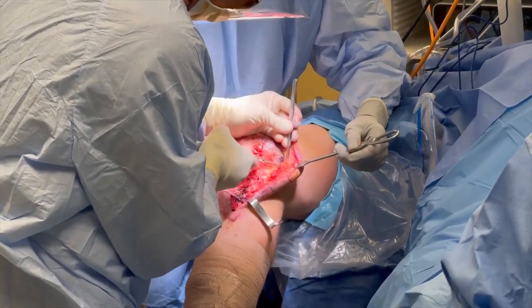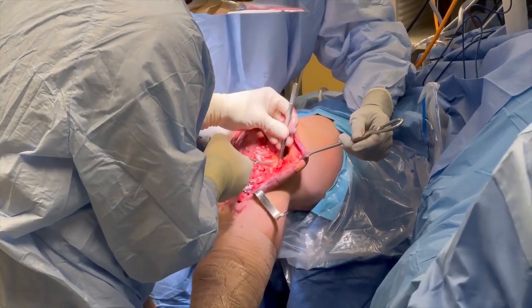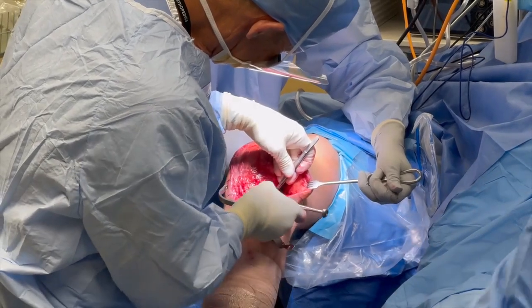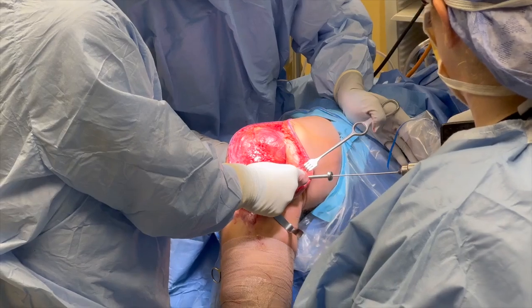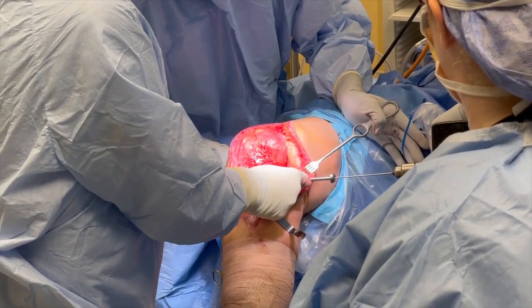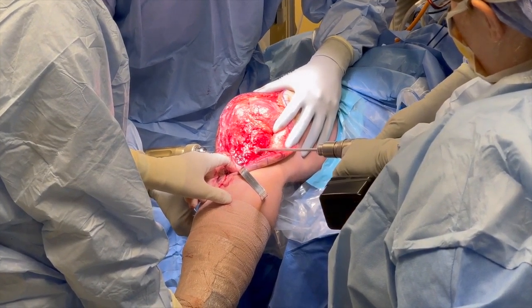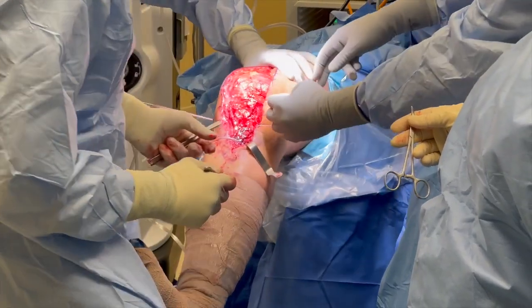Next, the site for the POL tibial tunnel is approached, just distal to the anterior arm of the semimembranosus tendon. This location is marked, and a guide pin is drilled perpendicular across the tibia using the collateral instrument tibial guide, exiting at Gerdy's tubercle. The guide pin is overreamed with a 7 mm reamer to a depth of 25 mm, and a passing stitch is placed.